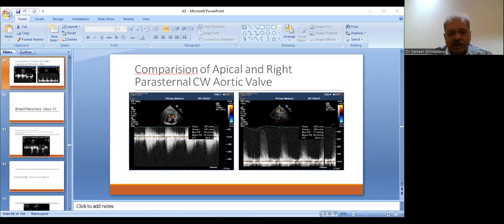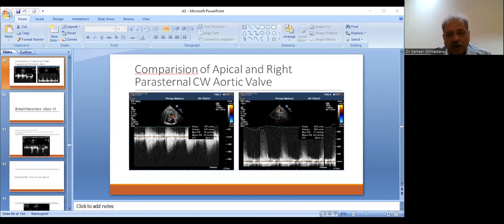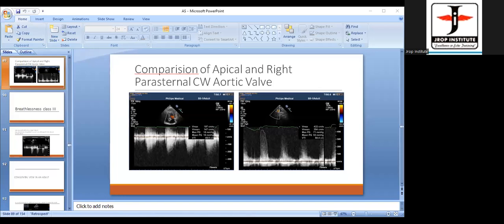Whenever you have early peaking, you are sure that you are not dealing with severe aortic stenosis. 3D is useful to document and confirm findings. There is doming visible in the transesophageal echo — a very beautiful doming — and it is also leaking. The leak appears mild on initial assessment but the stenosis is still present.